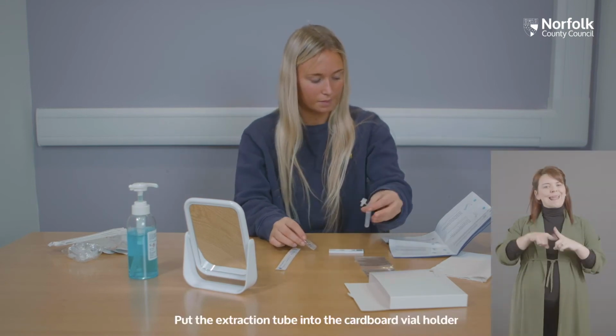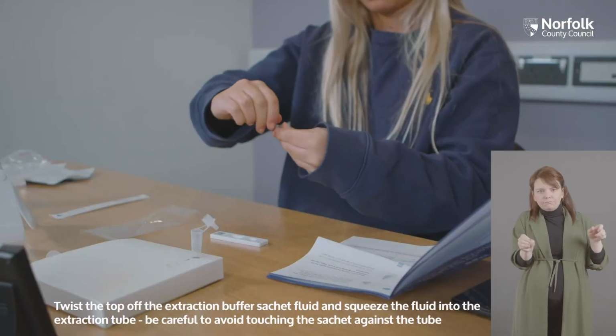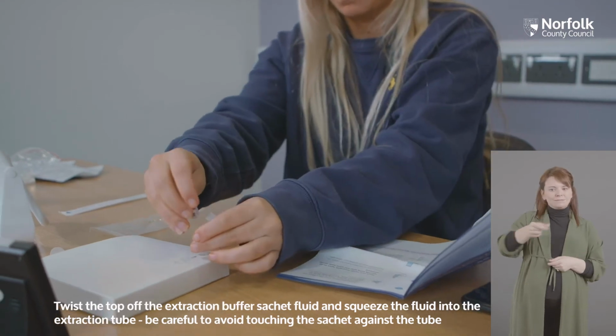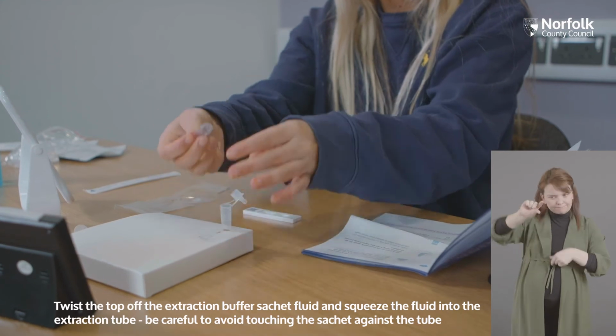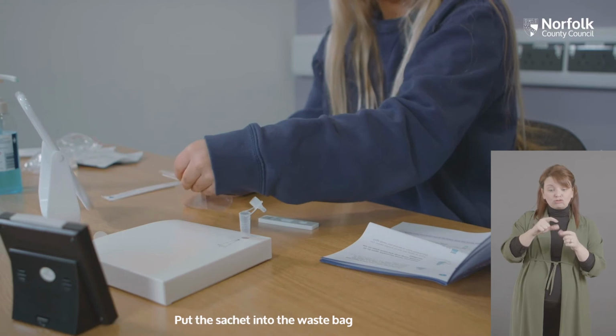Put the extraction tube into the cardboard vial holder. Twist the top of the extraction buffer sachet and squeeze the fluid into the extraction tube. Be careful to avoid touching the sachet against the tube. Put the sachet into the waste bag.